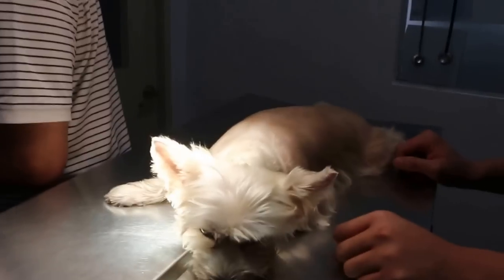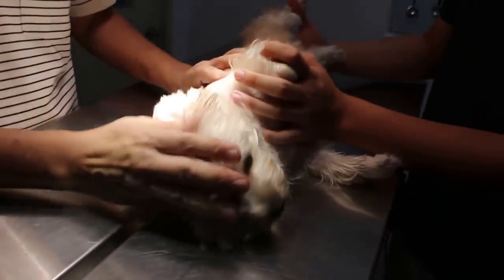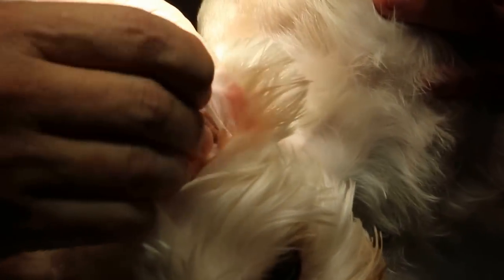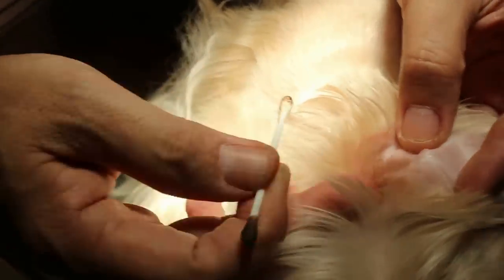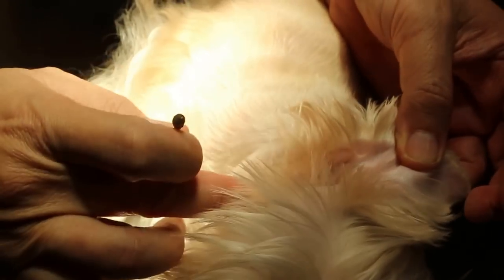Now you can see the dog is definitely not so worried. We can check — definitely the dirt is there, it's very deep. The owner or groomer has tried whatever she can but couldn't solve the problem because it's too deep. Today we have 2 cats with the same problem of black wax in the ears — so 3 in a row: 2 cats and 1 dog. The groomer can't clear the dirt from the horizontal canal because this canal is vertical, and there is another horizontal canal. So now I am going to irrigate the ears.